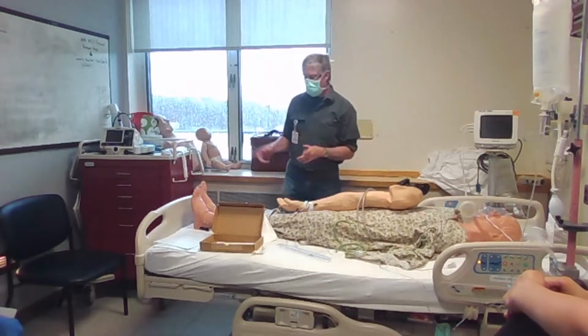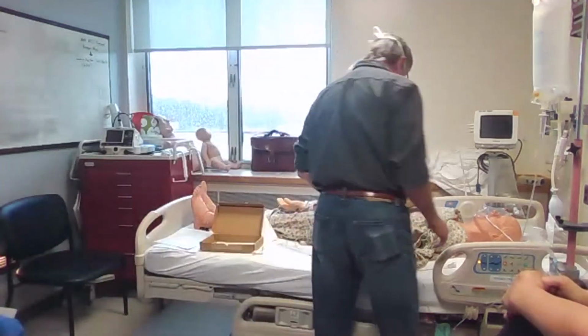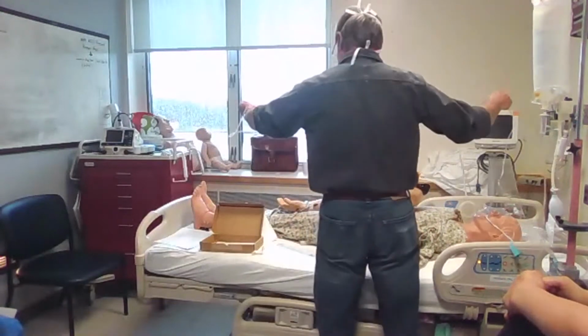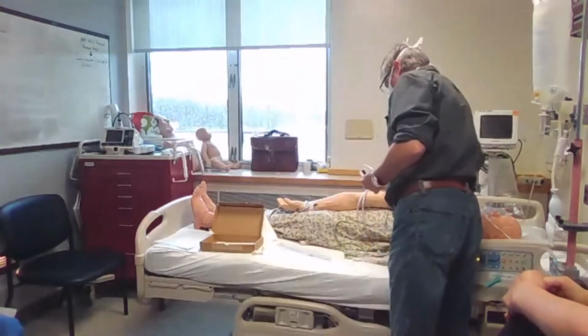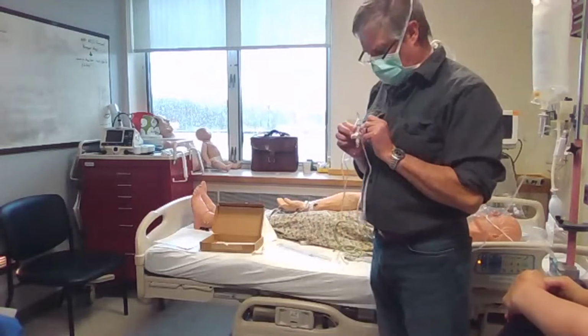Okay, so now we're going to zero. I call it zeroing, but what this is, is a transducer, which is called, where did it go? There it is, Wheatstone Bridge. This little part right here, that's what they call a Wheatstone Bridge.